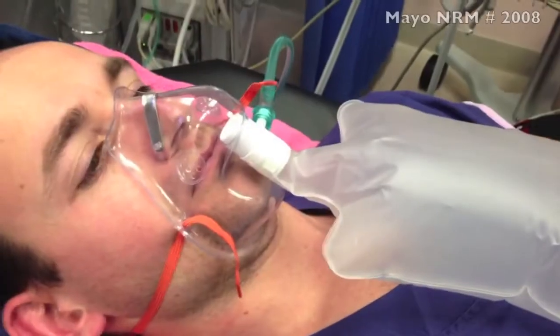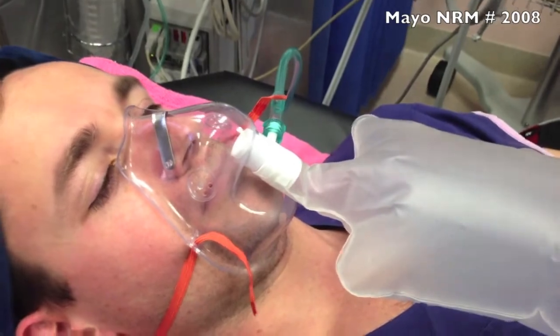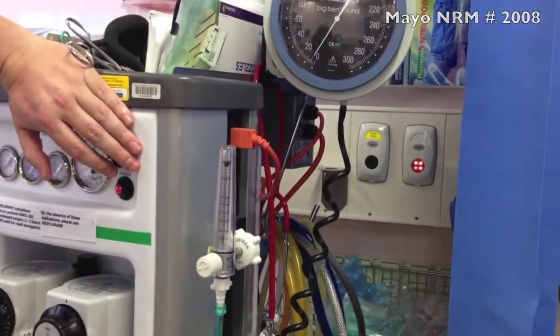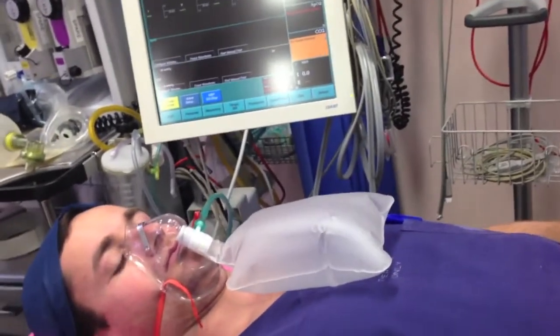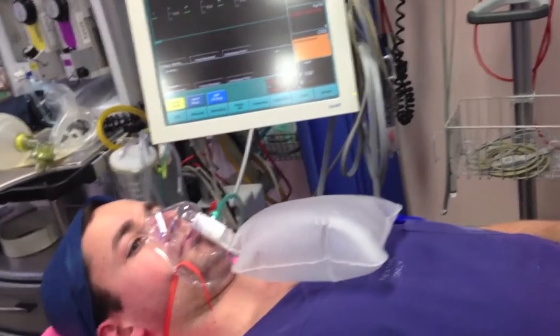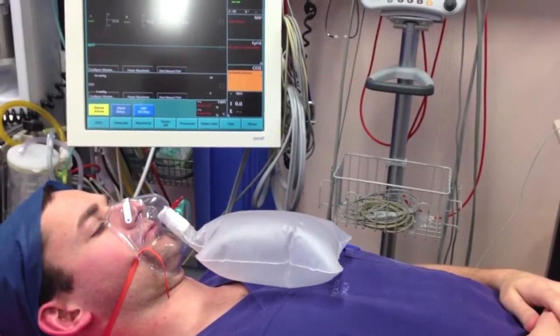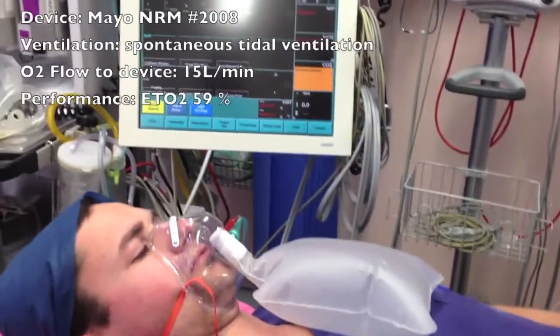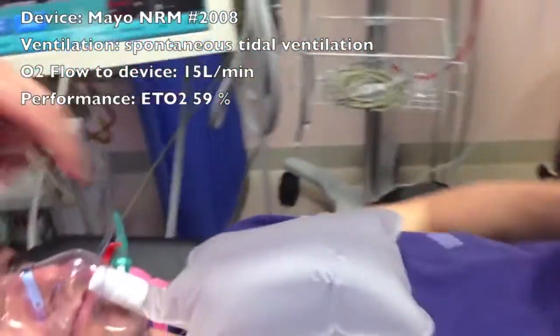The standard Mayo non-rebreather mask has a valve between the mask and the reservoir bag. During expiration, this valve closes, preventing the expired gas from entering the bag whilst allowing fresh oxygen flow, which would otherwise be wasted, to accumulate in the reservoir bag. During inspiration, this valve opens and the accumulated oxygen in the reservoir bag supplements that being delivered by the fresh oxygen flow. Thus, a greater proportion of the inspiratory flow is met by the 100% oxygen sourced from the fresh oxygen flow and the reservoir bag.